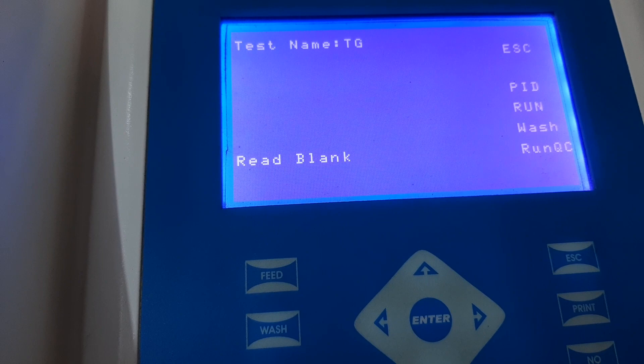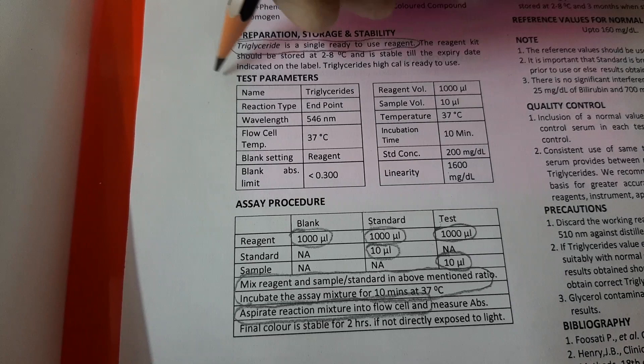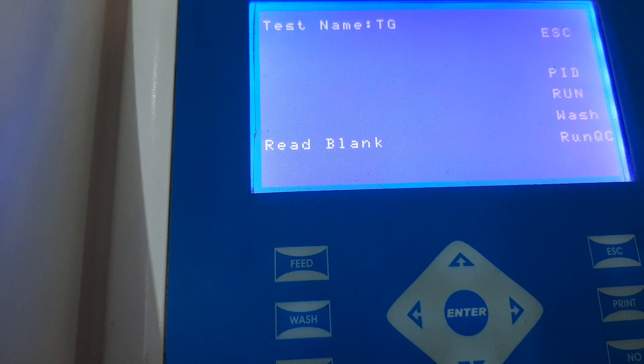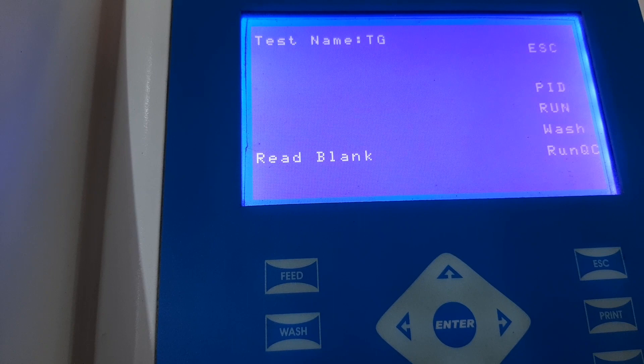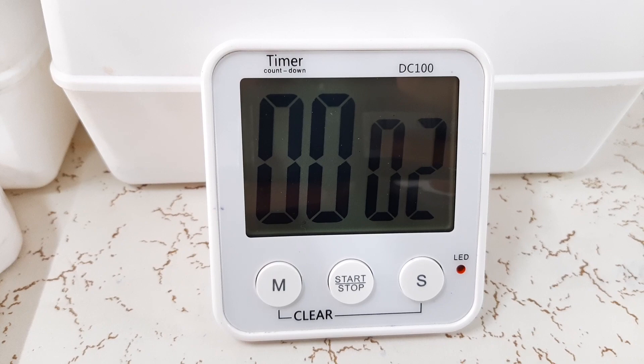Please note that while the incubation is going on, switch on the instrument, open the program, and keep it ready to read the blank. Please refer to a separate video in which we have explained clearly how to program the triglyceride kit on any semi-automated biochemistry analyzer using the information provided in the instructions for use. We have opened the program and kept it ready, and the program gives a message to read the blank after incubation is over.